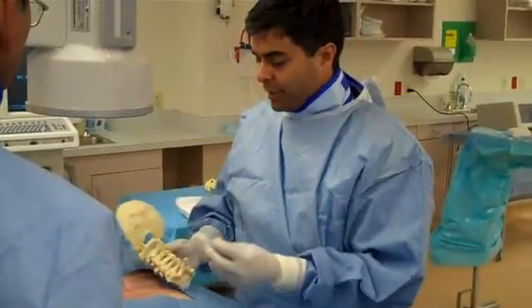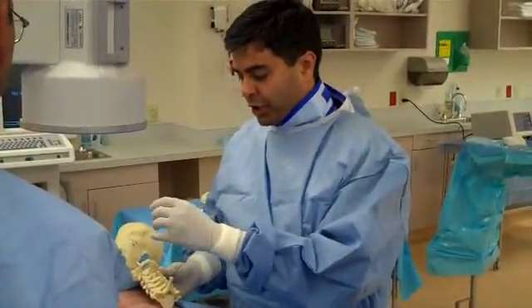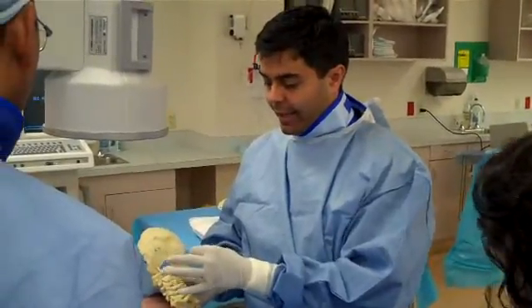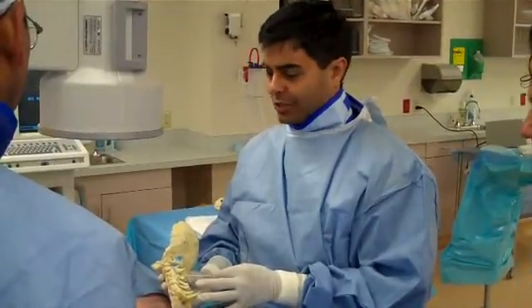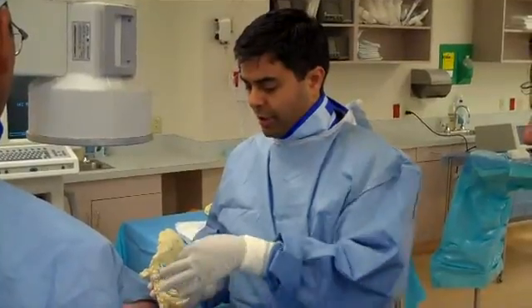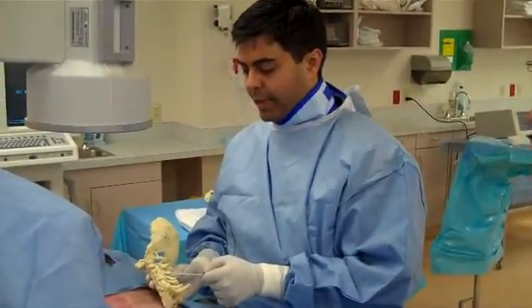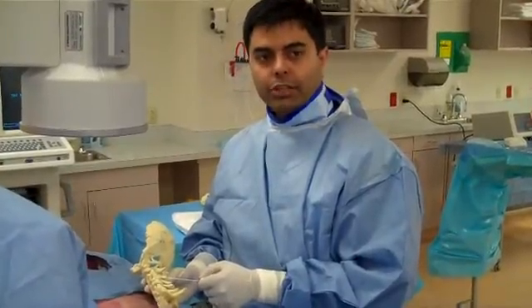How do we go about this? If you're going to have a straight posterior-anterior view, you're essentially going to go until you hit the lateral portion of this, slide off the tip of that, and then angle your curve to kind of wrap around. What ISIS teaches is that you should have three different approaches — a straight approach and an angled approach to get around the side. I don't generally do that. I generally just go with one approach, then direct and turn my needle and reposition it to get those three lesions.